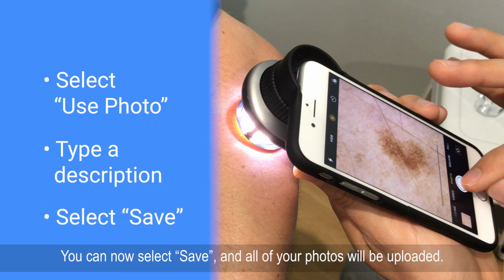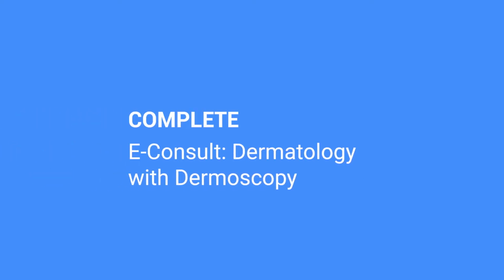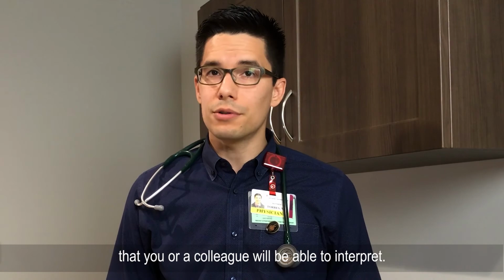You can now select Save and all of your photos will be uploaded. For your final steps, insert and label your scout photo, your polarized photo, and your non-polarized photo into your note. If you haven't already, complete the e-consult Dermatology with Dermoscopy. Submit and complete. Here are some tips for obtaining high-quality images that you or a colleague will be able to interpret.